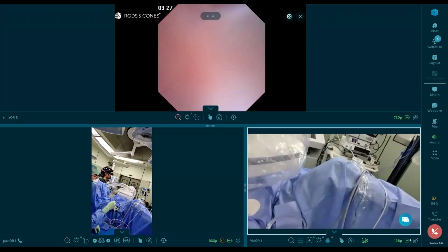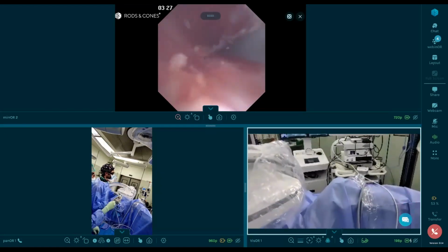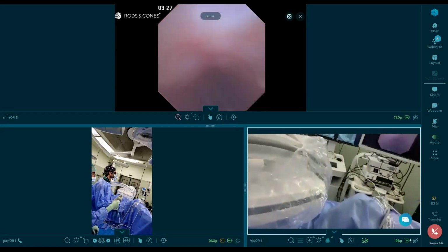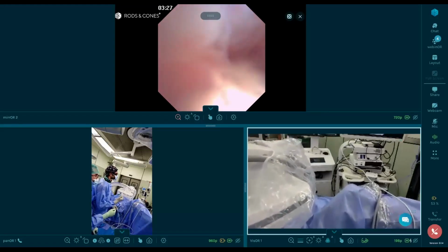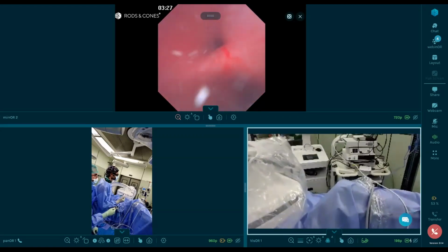And then you use the guide wire to get in. That's the trick. And we'll leave the guide wire in at the end. But that's the trick if you have some difficulties to get in. You can see the dust coming already from the ureter. So it's already clearing.